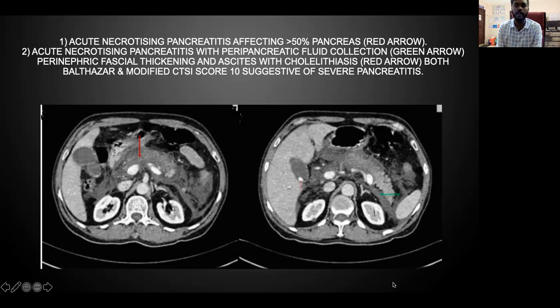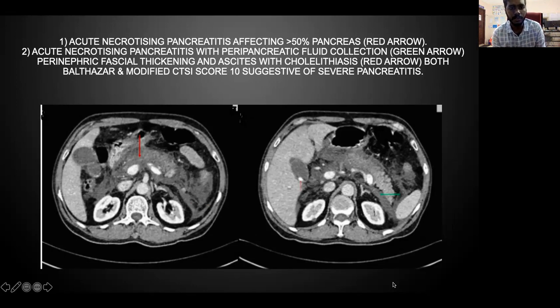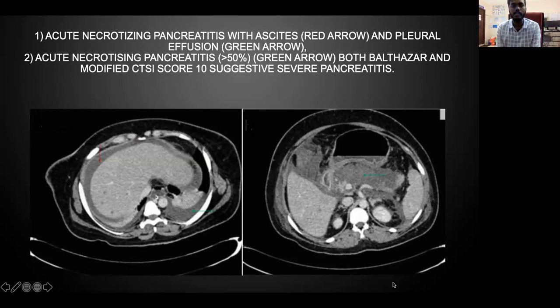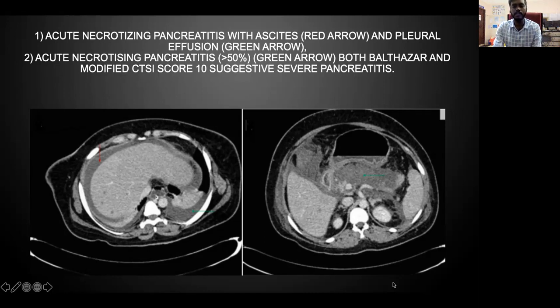The first image shows acute necrotizing pancreatitis affecting more than 50% of the pancreas, and the second image shows acute necrotizing pancreatitis with peripancreatic fluid collection. Both scores were in the severe pancreatitis range. In another case, both scores were 10, indicating severe pancreatitis with more than 50% of pancreatic parenchyma involved.